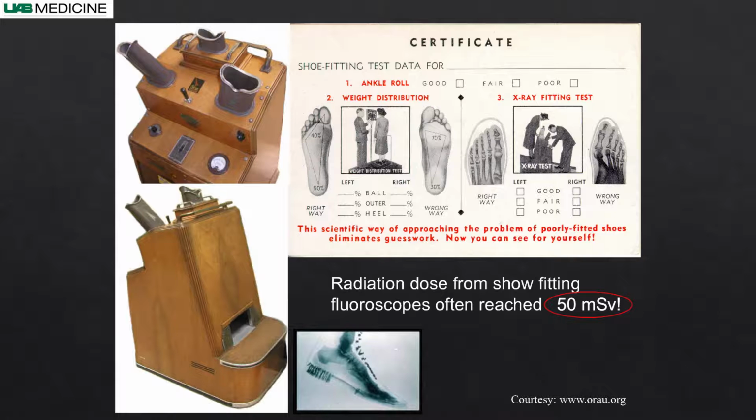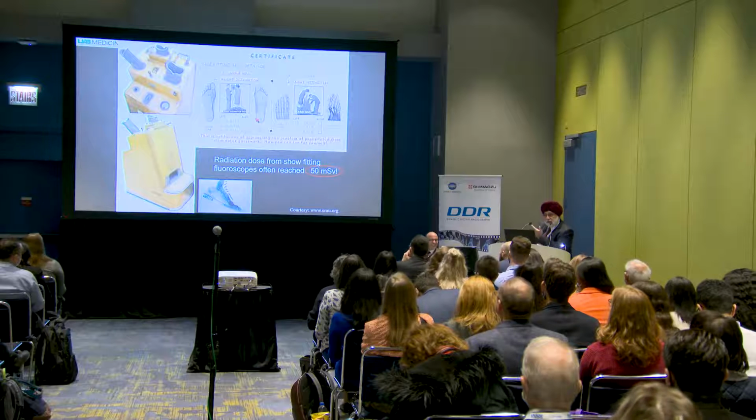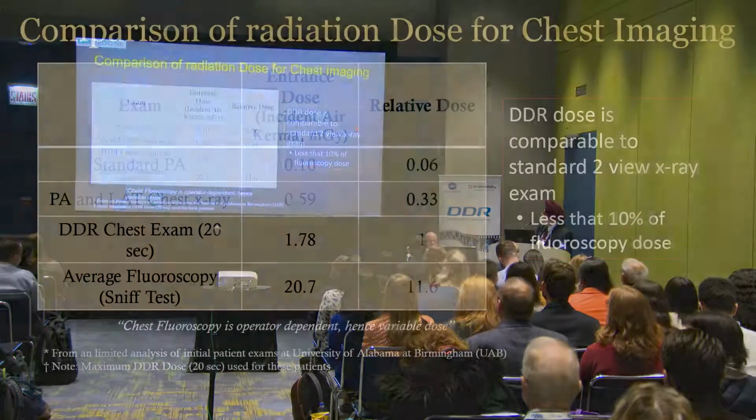And this is a really great idea: the shoe fitting test. Ladies would come and put their feet, with the shoe, inside. They can watch through this tube here, and the person fitting the shoes looks into it and takes a lot of measurements. You wiggle your toes and find out whether it fits or not. There's an issue: radiation can go up to 50 millisieverts, no problem. It's just that you are getting a good shoe fitting. So I'm not sure whether Dr. Soul has seen this or not. It might put him into bankruptcy.